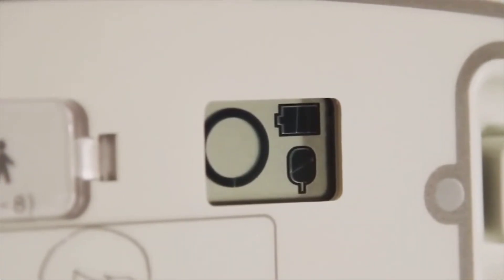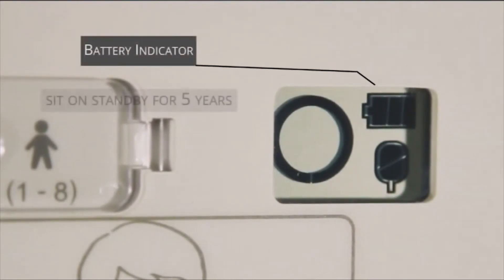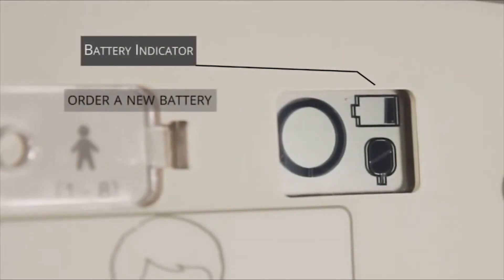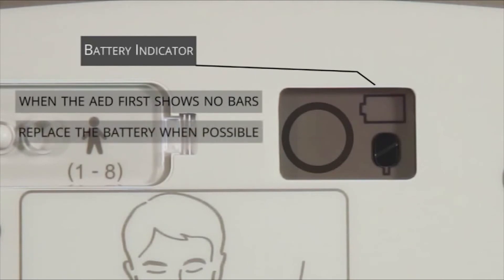The battery status indicator will inform you of how much battery power remains in the non-rechargeable battery. When installed, the battery has enough power to sit on standby for five years. When the battery indicator is at one bar, a new battery should be ordered. When the battery indicator changes from one bar to no bars, the battery should be replaced at the earliest opportunity.